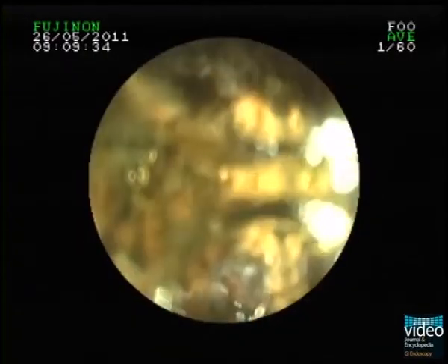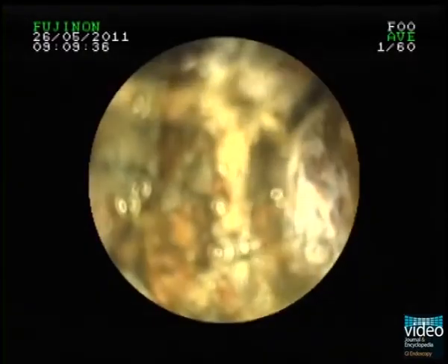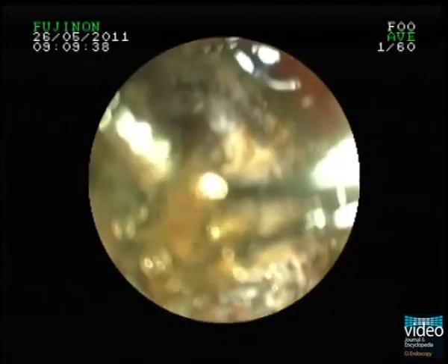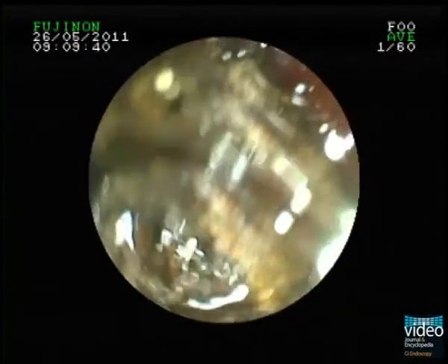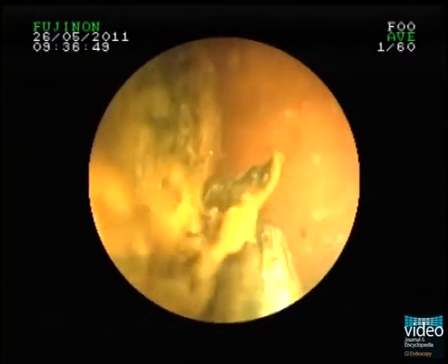Now the stone is directly in front of the endoscope. We remove the balloon catheter and fill the common bile duct with physiological saline that is infused through the working channel.